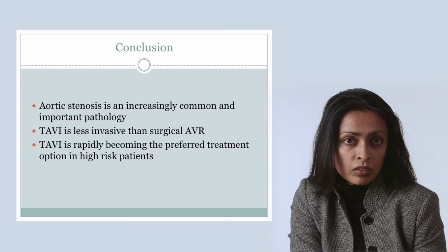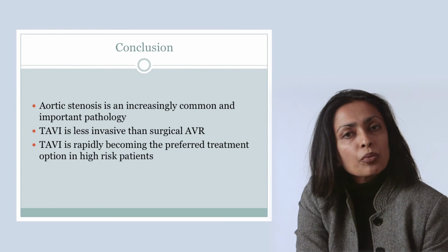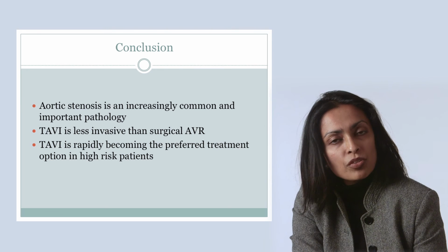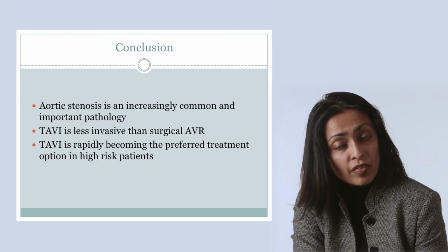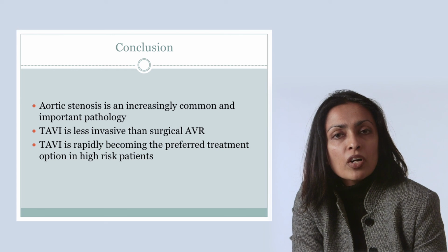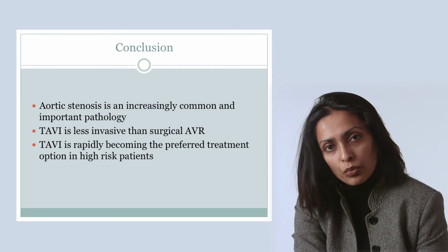In conclusion, aortic stenosis is an increasingly common and important pathology. Transcatheter aortic valve implantation is less invasive than surgical AVR and is rapidly becoming the preferred treatment option in high-risk patients.